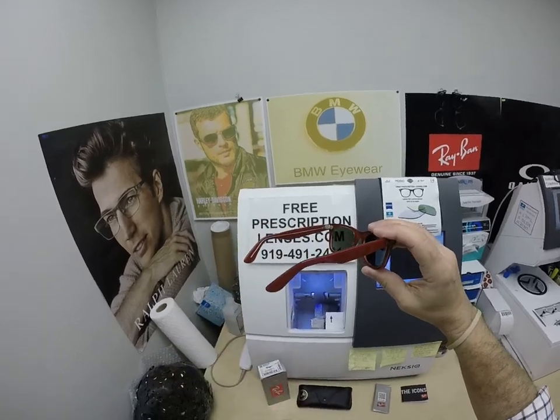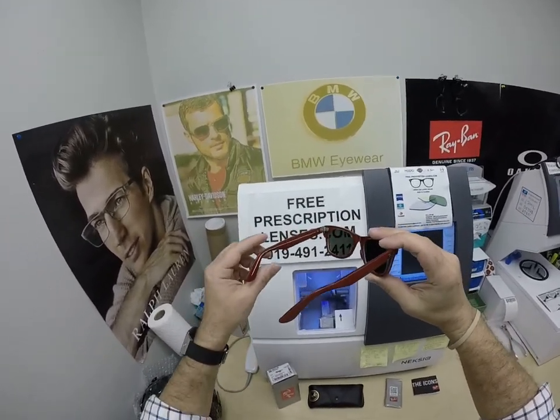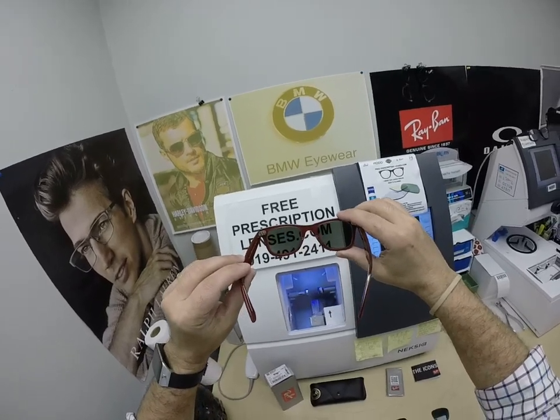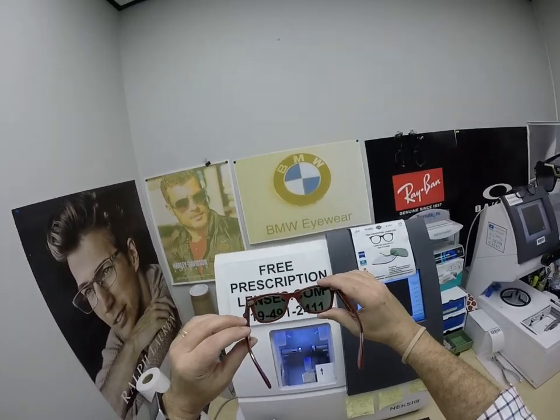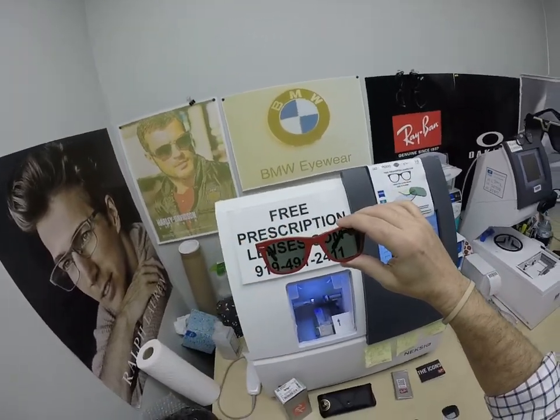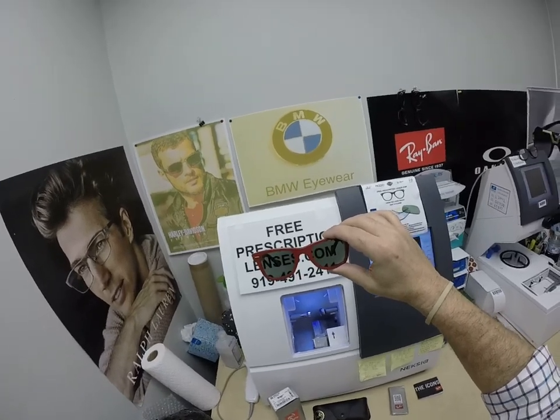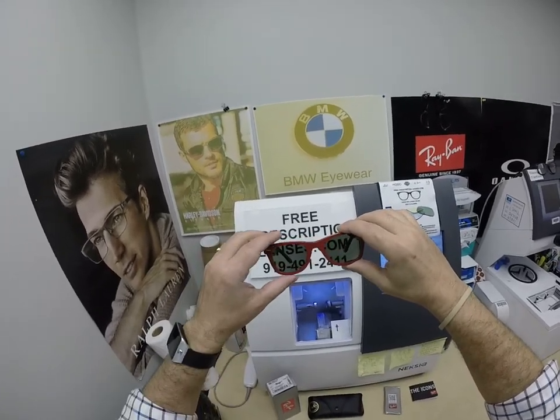Having said that, there is the Zeiss Photofusion Extra Gray that will get darker in hotter weather. The nice thing about the Zeiss Photofusion lenses: photochromic lenses were the original blue-blocking lenses, so they will block 30–50% of the harmful blue light emitted from today's electronic devices. The Photofusion Extra Gray will block 50–70%.